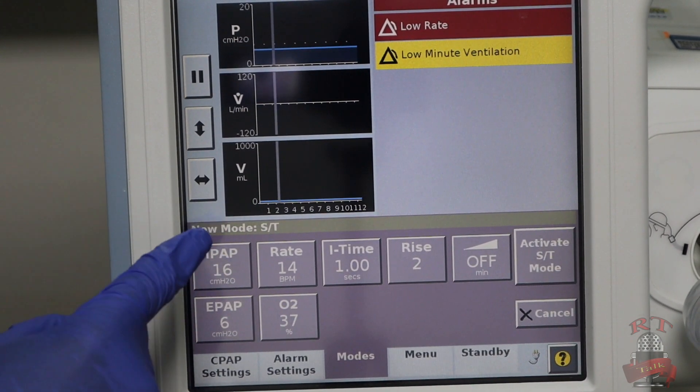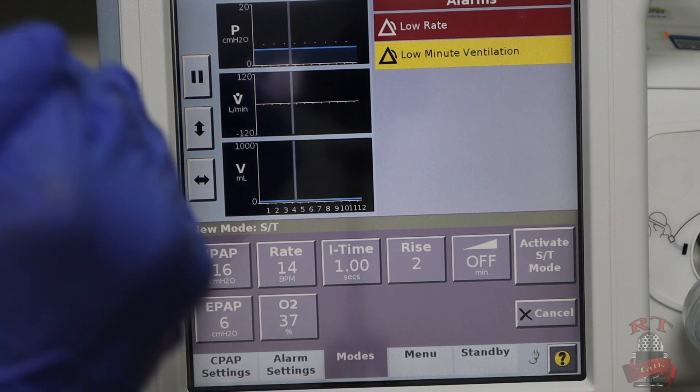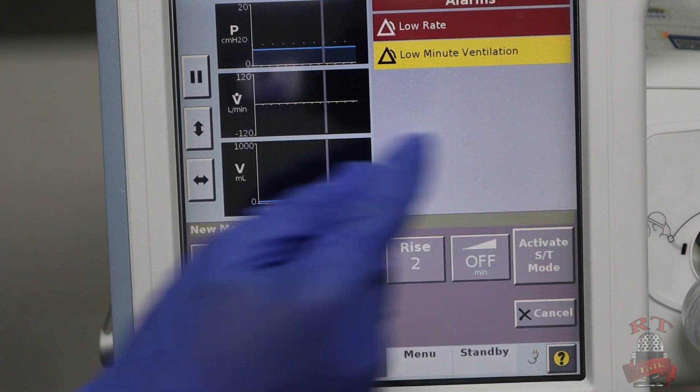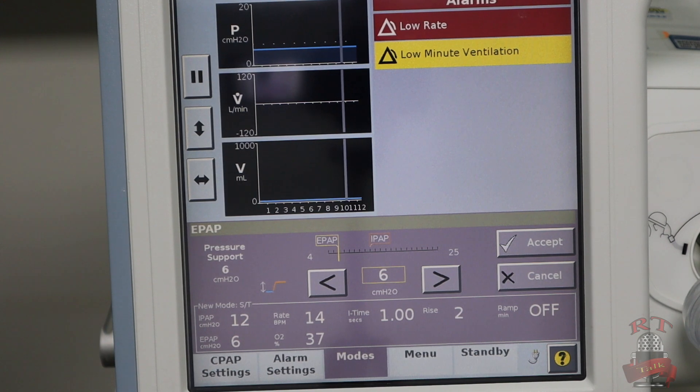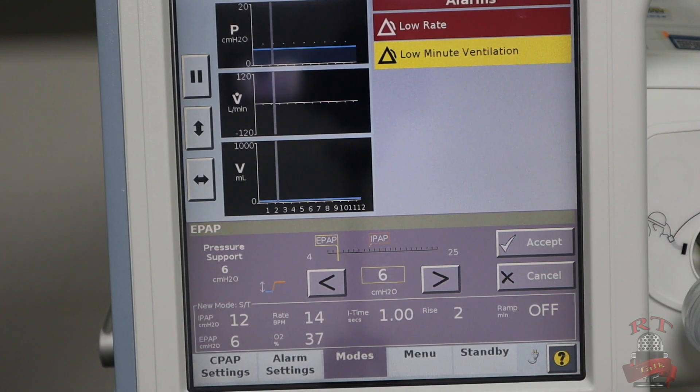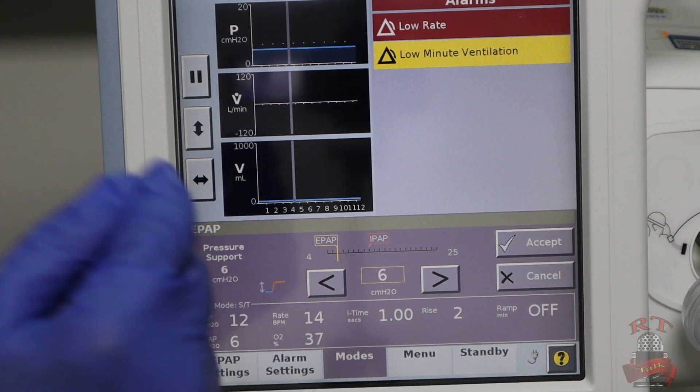First, your IPAP, which is inspiratory positive airway pressure—I will start it with 12. Your EPAP, which is expiratory positive airway pressure, is mainly for oxygenation. So I will keep it at 6.